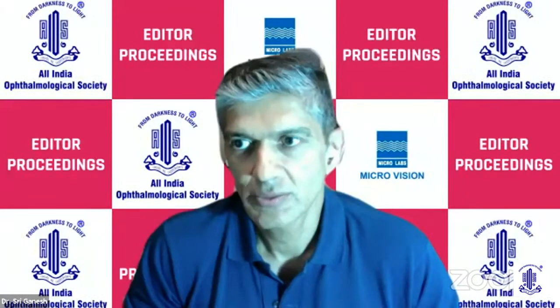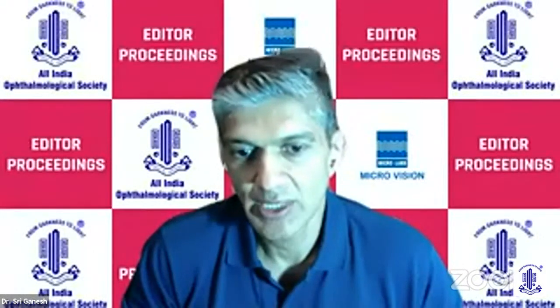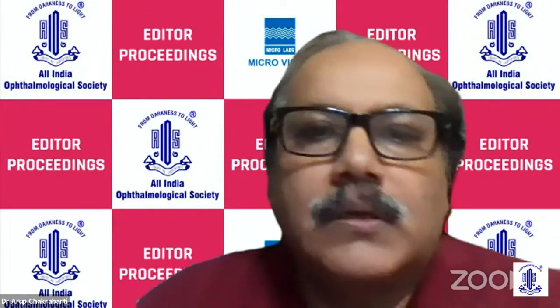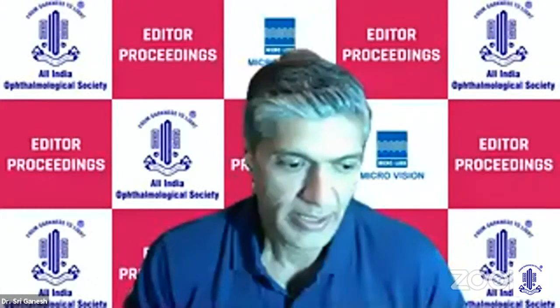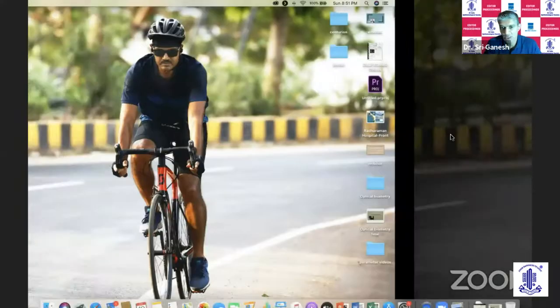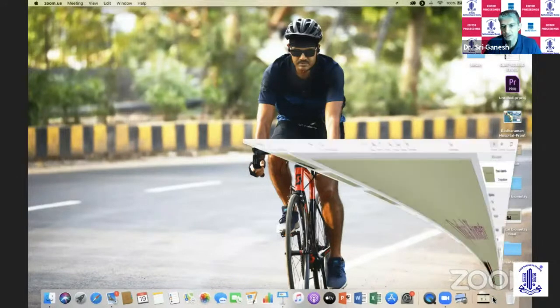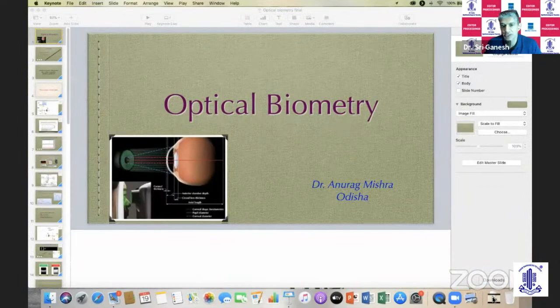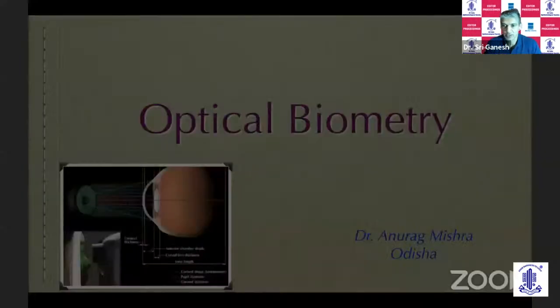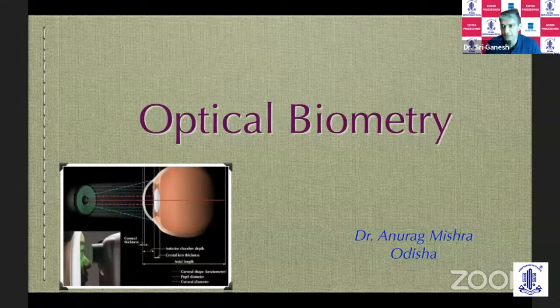Arup, I just wanted to make one point. Now, most of us are using optical biometers, but sometimes we encounter a mature cataract. Sometimes the biometrists just use the ultrasound and then they enter the axial length into the IOL Master 700 and do the calculation, where you can get an error because basically the ultrasound biometer measures up to the internal limiting membrane, whereas the A scan of the IOL Master 700 is up to the RPE.